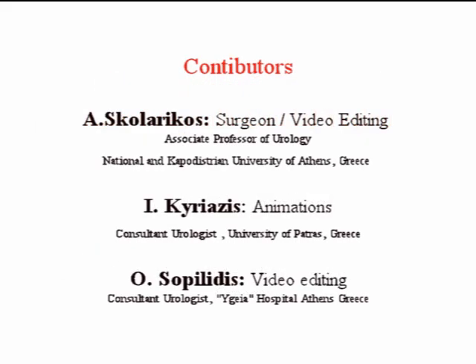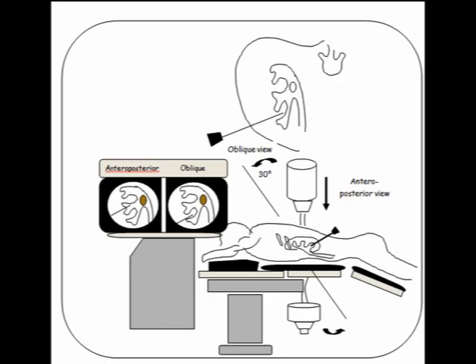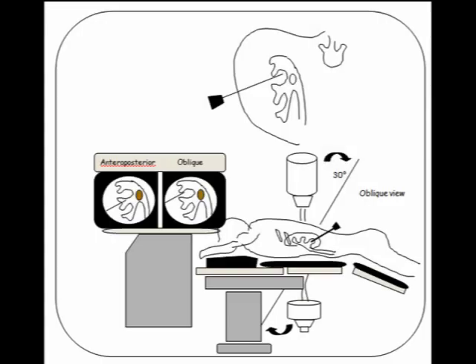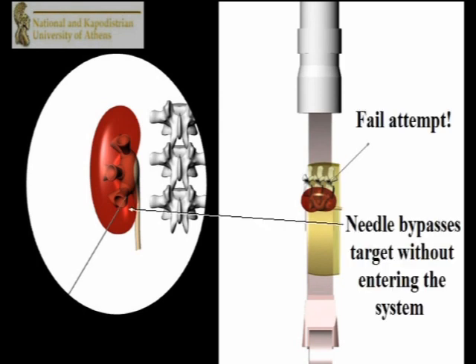With a biplannar fluoroscopic technique for access to a posterior calyx with cephalocaudal C-arm rotation, the image intensifier is set initially in the vertical position. This provides a perpendicular view of the needle.